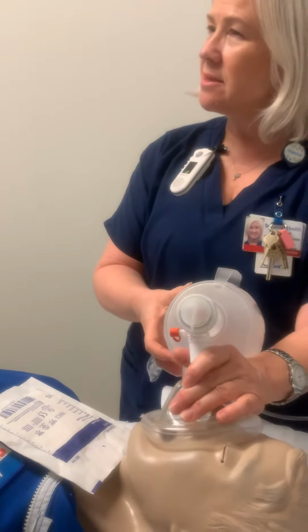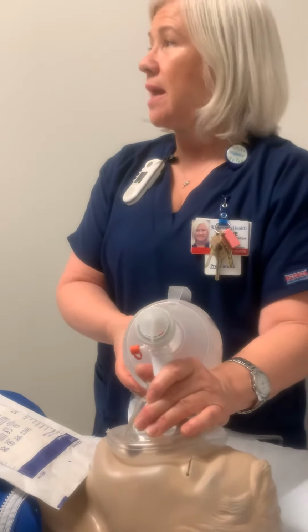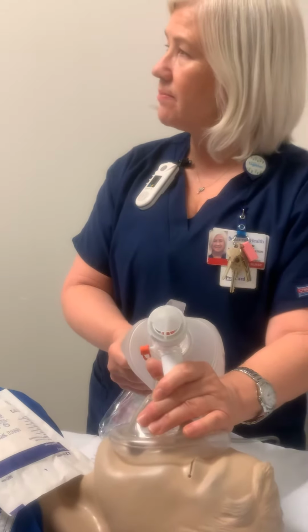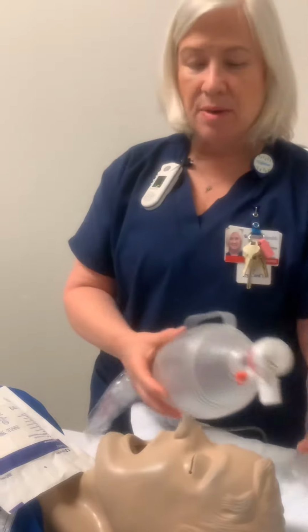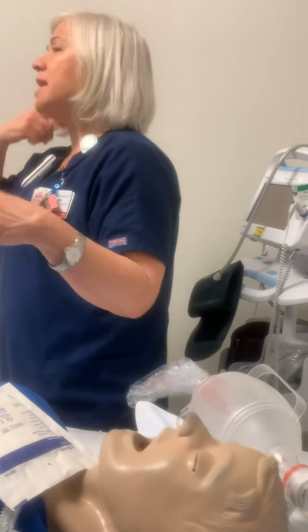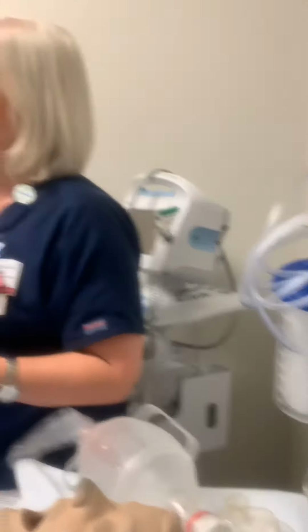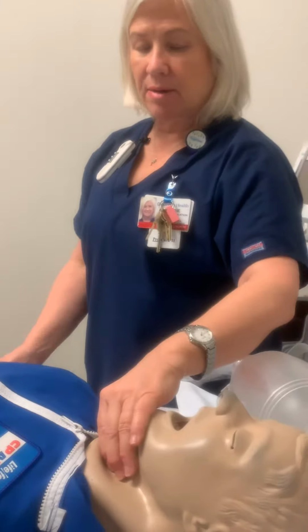Does that make sense? This is only if they're not breathing. You still pretty much want to do it anyway, so just cover it here. Okay, you can ventilate them, but watch their sats too. They may not always need it. They might be okay. If it's an established trach and it's been there, say, a year or two, which sometimes they do, especially if they've had their larynx worked on, then you can still ventilate them here.